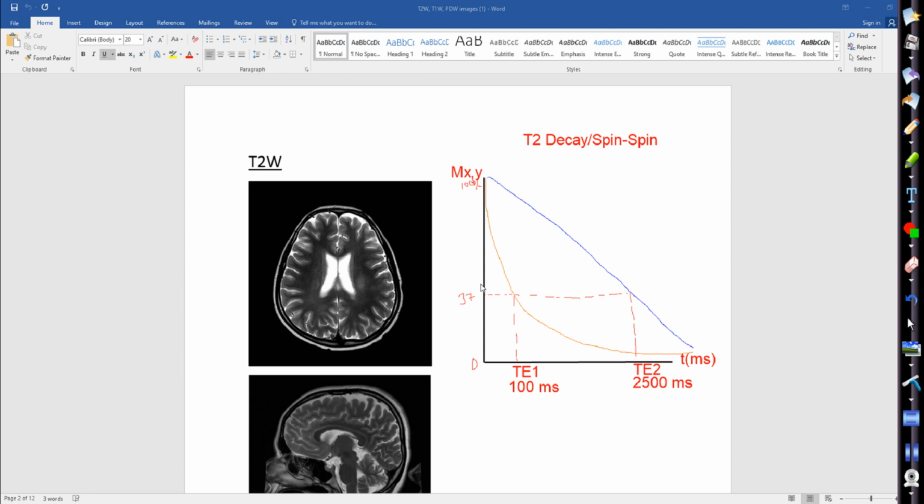All right, so now let's draw our lines over. Water is going to make the most sense for this curve because it is bright white. So you can see that we still have a large amount of signal wherever we sample it. Okay?